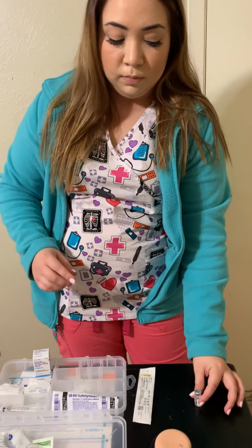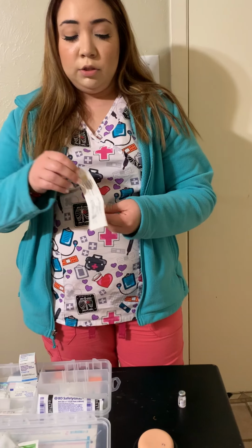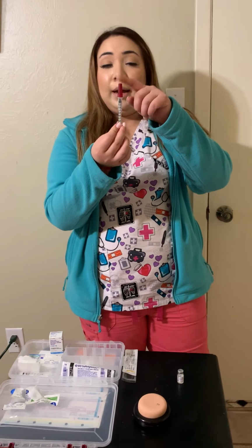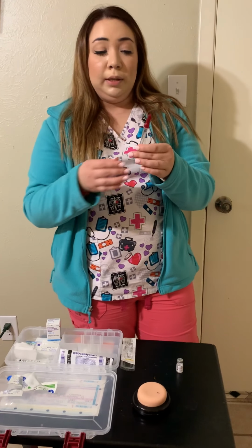Okay. And we'll let that air dry. So we're going to take our syringe. This is a tuberculin syringe. Normally, these are capped with red caps, meaning they are specifically for TB testing.